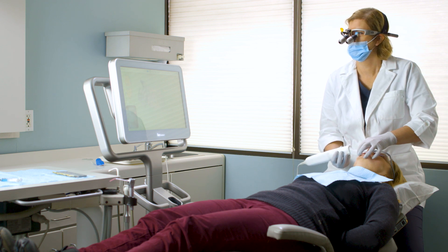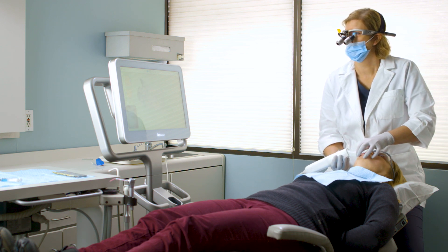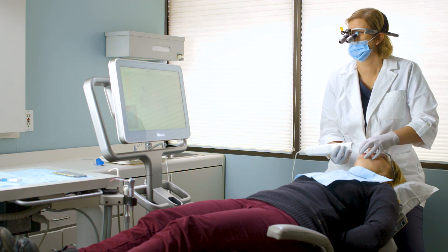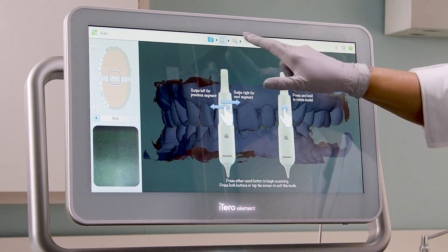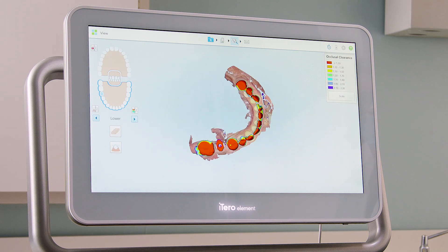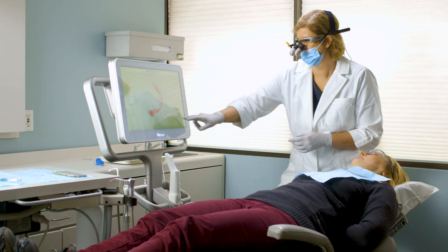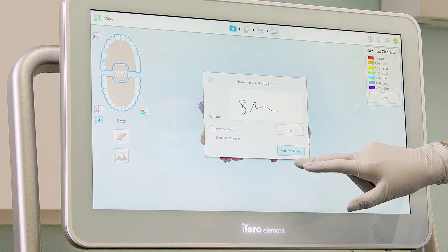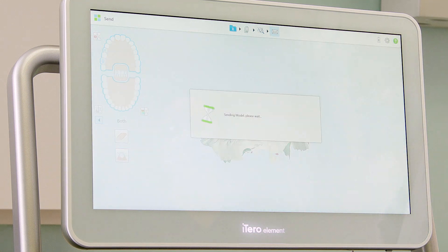I can remove the scan body if it impedes the patient being able to close in proper occlusion. When I have captured all the required anatomy, I will tap the view icon to review the digital model in high resolution. I will review each arch individually, as well as the two arches in occlusion. If I need to add any scans or make any adjustments, I can do this now. When I am satisfied with the digital model, I will send the case.